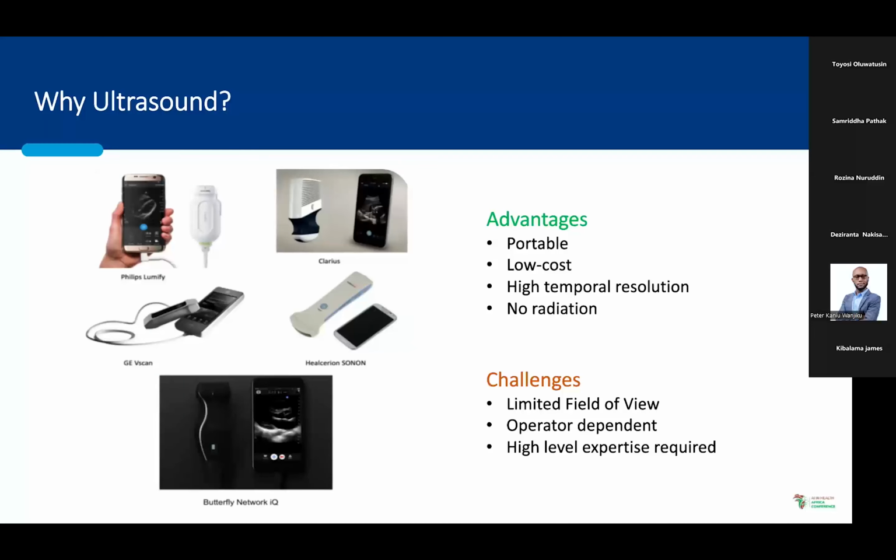There are also some challenges associated with ultrasound, such as the field of view is a bit limited because you capture ultrasound in a plane, and it is operator dependent. You need experts to find the right set of views. The quality of the image, as well as the semantic content of the images, depends on who takes it. So these are the challenges that exist with ultrasound.